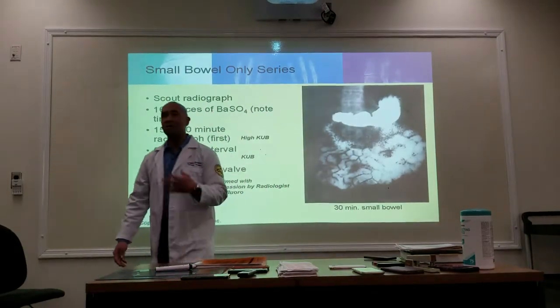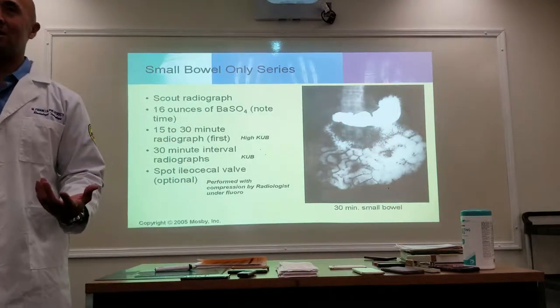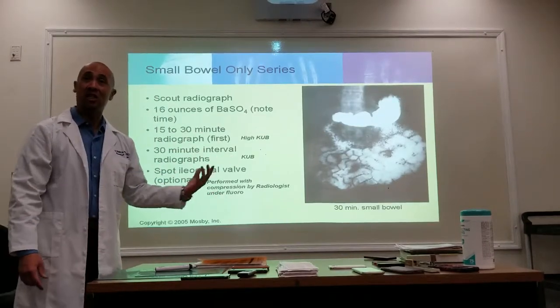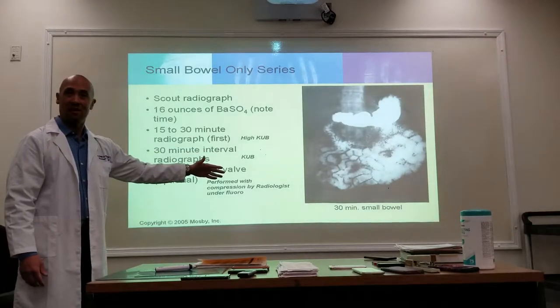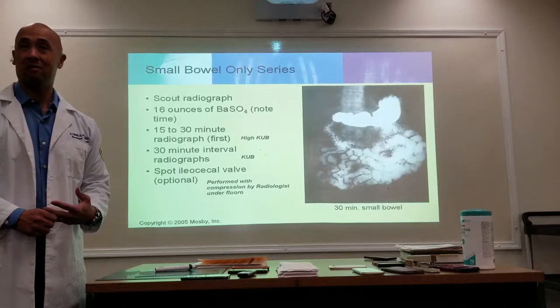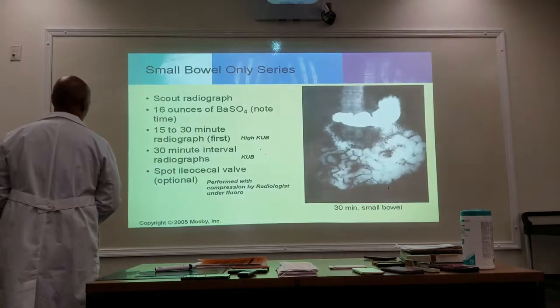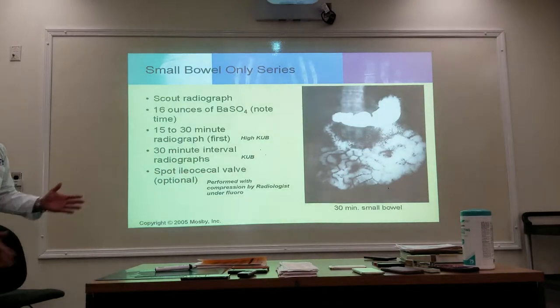Well, how do you know if you're going to center high or center low? Well, you're the ones taking the images, right? So look at where the barium is in your previous shot and adjust accordingly. If the barium is still high, still keep it at a high KUB. If the contrast is moving more towards the middle and distal part of the small bowel, then start taking your regular KUBs. Make sense? Any questions?